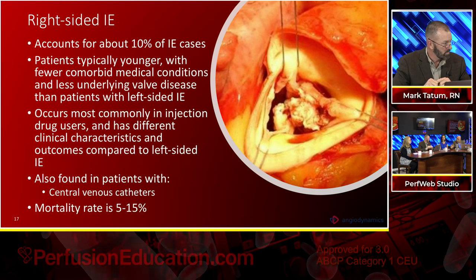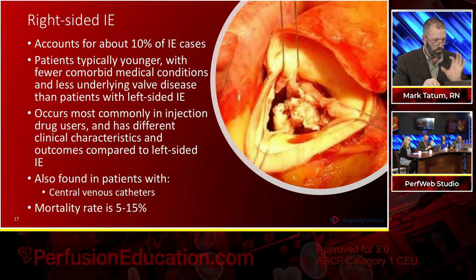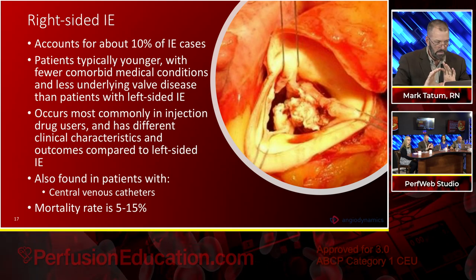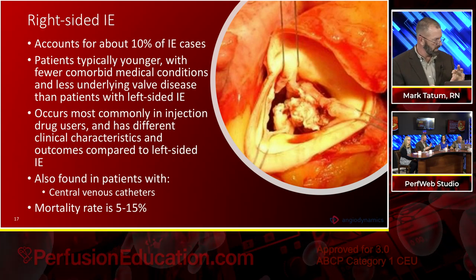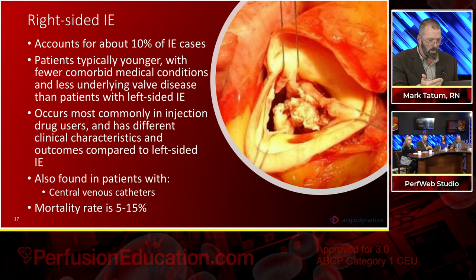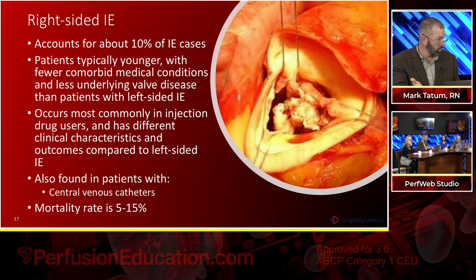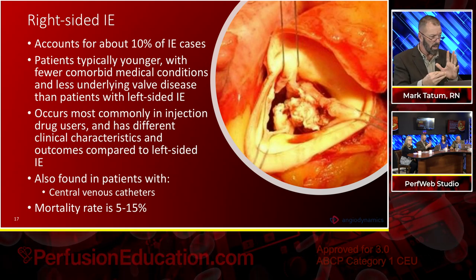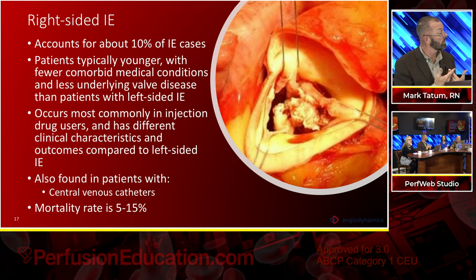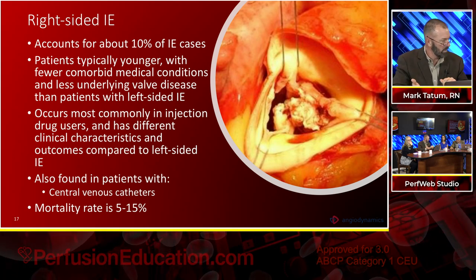The leaflet itself, indeed. So, it's a great question. With the 14 millimeter circle that we have at the end, the funnel opening, it doesn't engage all of the tissue at one time to be able to cause damage. Second, even when you're flowing at 3 to 5 liters per minute, the negative pressure on the outside of the cannula is roughly 30 to 40 millimeters of mercury negative. It isn't until you actually occlude the cannula that you get the really high negative pressures that can remove the material in the first place. So damage to the valve as a result of the utilization of the cannula isn't what we see.